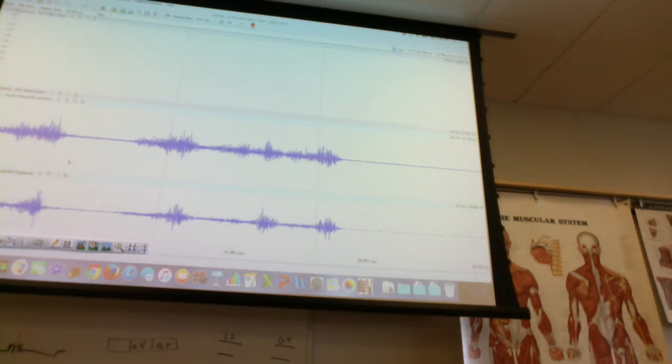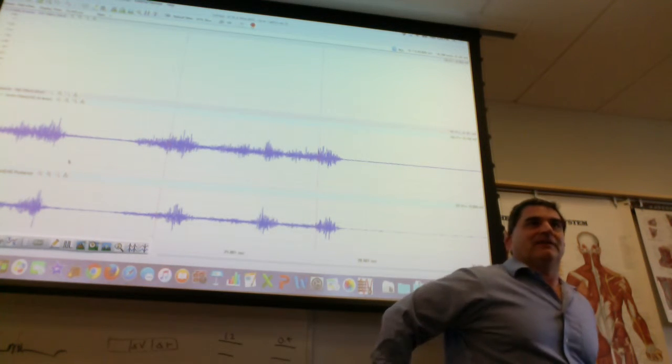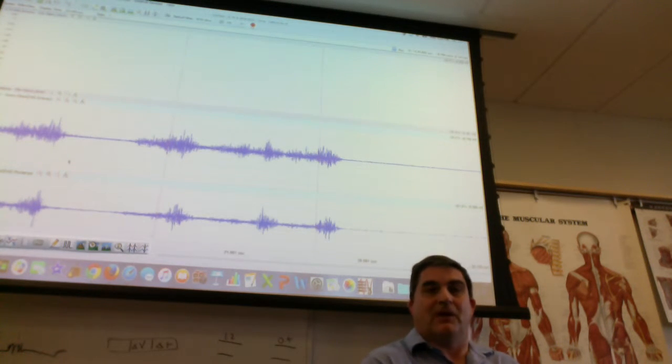Okay, it looks like everybody's pretty good here, right? So what we're going to do next is we're going to work on the first portion of this. We're going to do some flexions and extensions. Now, this is going to be without a weight, so you should be sitting there. And imagine you're sitting here. You're going to flex, and then you're going to extend back to your knee. Are we pausing in between? No. Well, yeah, so just a second.